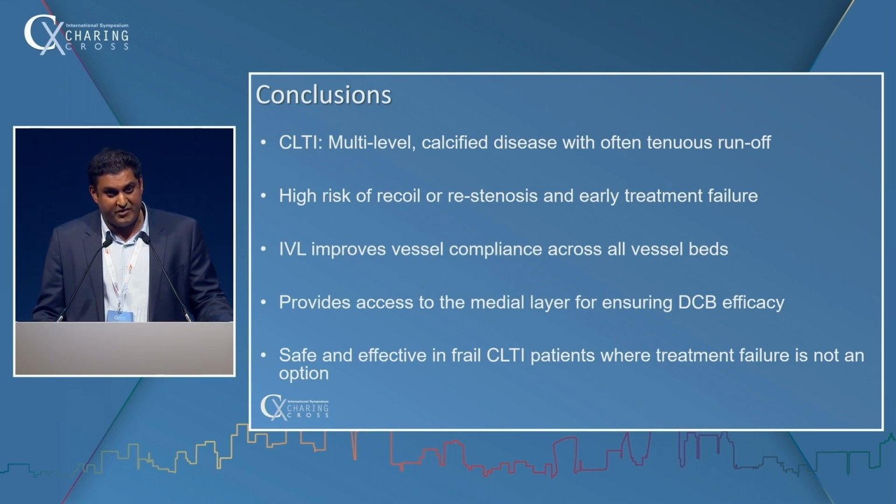IVL, in my hands, improves vessel compliance across all vessel beds, and it especially allows access to the media of these vessels so that our DCBs can actually have effect. So hopefully I've convinced you that IVL is safe and effective in CLTI patients where treatment failure is not an option. Thank you very much.